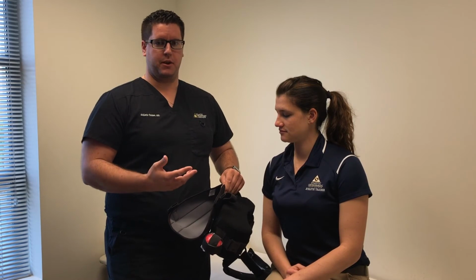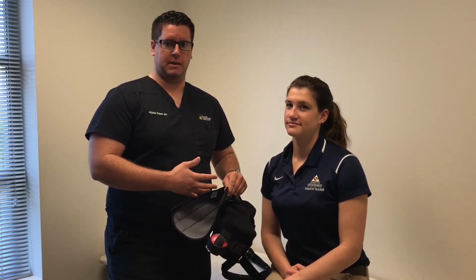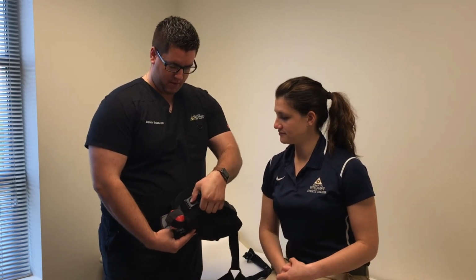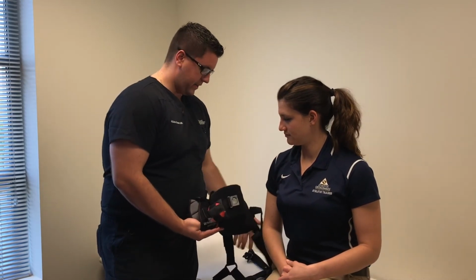Whenever you're doing something like putting on a shirt, put your bad arm in first. Same thing with putting on a sling. Put your bad arm in there first to rest. So I'm going to have Christine do that, and obviously the pillow over here as well can be undone with the swath. That's going to go onto her side.